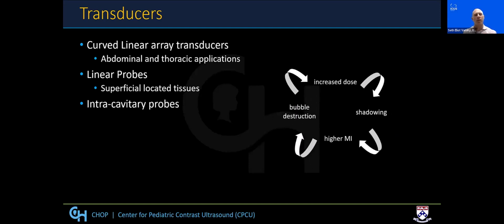So we really want to try and lean towards utilizing those low frequency curved probes wherever we can. And as Dr. Dennis touched on, selectively using our linear probes when a curved probe is not appropriate for visualization. Additionally, in specific instances, we may consider intracavitary probes. We use that more frequently with intracavitary injections, which I won't be touching on today, but certainly is an area of our use and practice currently as well.